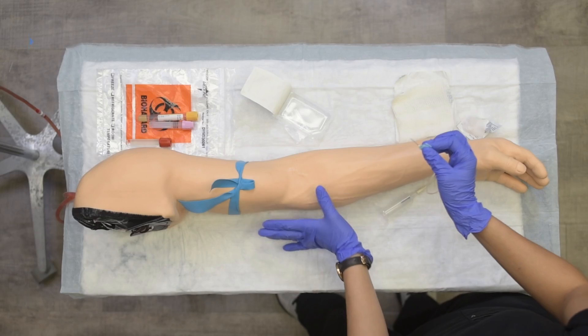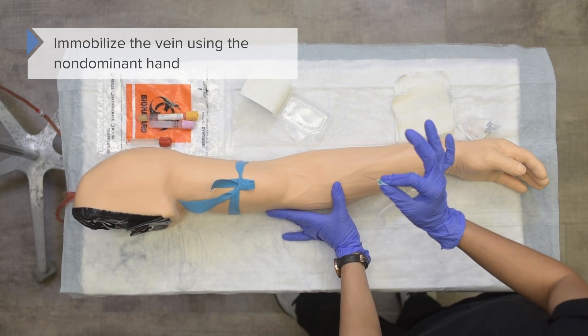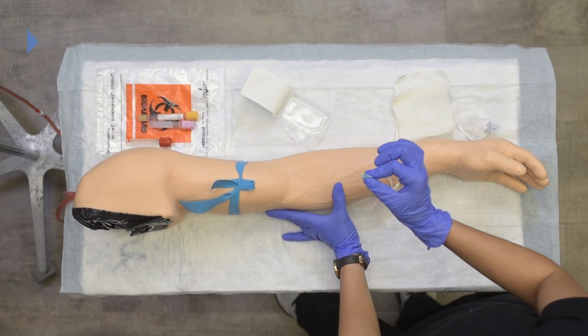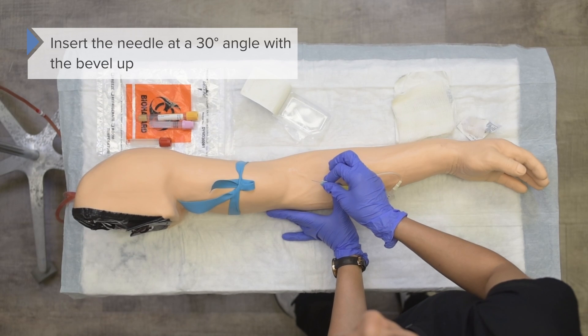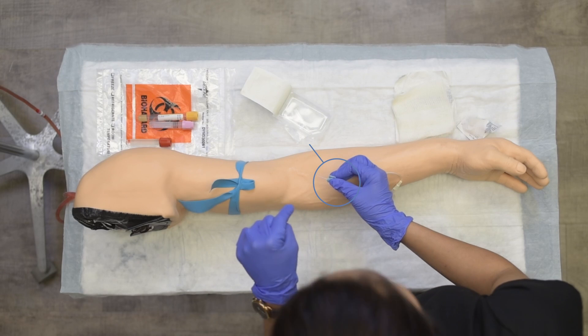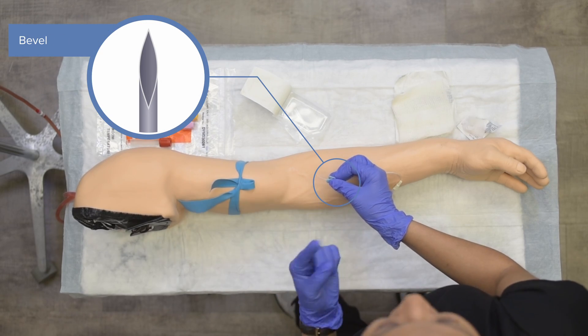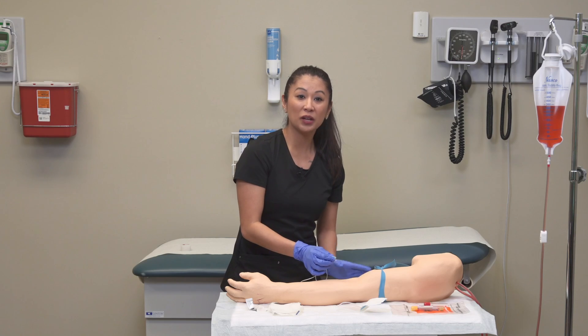Once I've removed the sheath, I can immobilize the vein using my other hand. With my dominant hand, I'm going to insert the needle with the bevel up. When talking about the bevel, if you look down at the needle, you should see the opening or hole of the needle looking up at you.